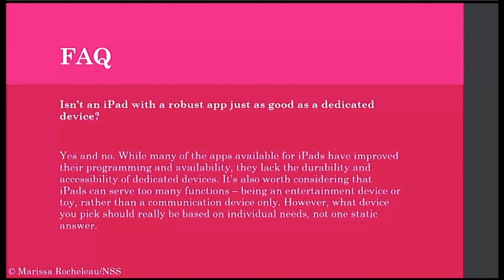And that can kind of confuse clients, especially younger kids, like, oh, how am I using this? This is my communication device rather than this is for me to watch YouTube. So the answer again is yes and no, because what device you pick really should be based on individual needs, not just a static answer of iPad yes, device no, or vice versa. It's really going to depend on what your client needs.